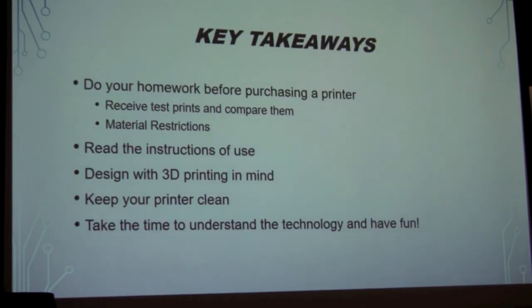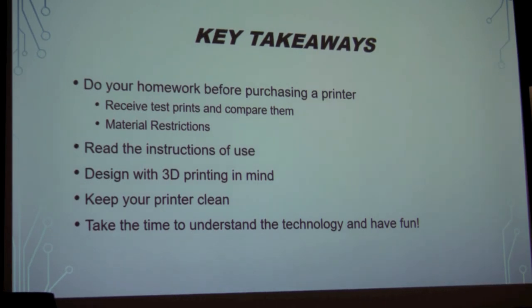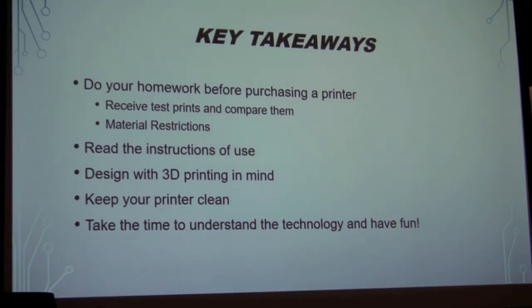So key takeaways: do your homework before purchasing a printer. Receive, test, and compare them. You know how to compare them now in-house. There are material restrictions on some printers, so if you're looking for a printer that can print any resin, make sure you look at an open source one. Read the instructions for use, extremely important. Design with 3D printing in mind. Keep your printer clean, and then take the time to understand the technology and have fun. So that's it.